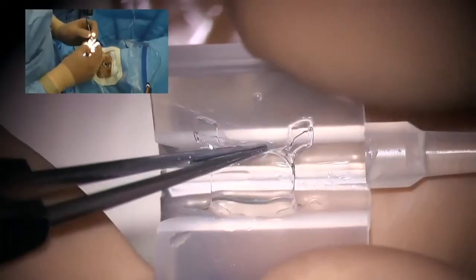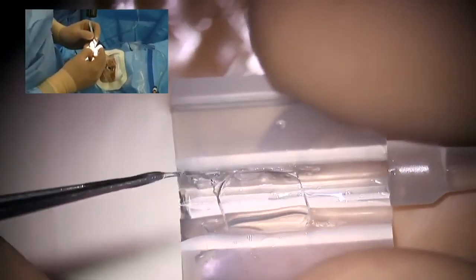You can see here that I'm trying to buckle up this IOL. This is because normally it's easier to unfold the IOL properly in the A.C., but you can also do it the other way around. You have to be very careful not to incarcerate the fine haptics inside this cartridge. You always have to check this prior to the implantation.